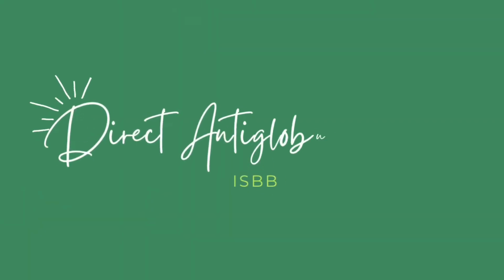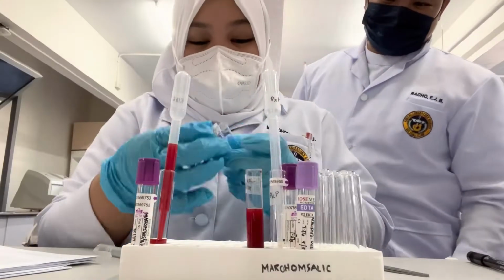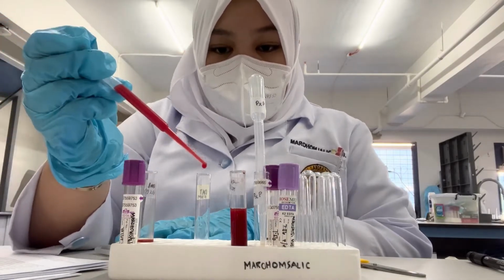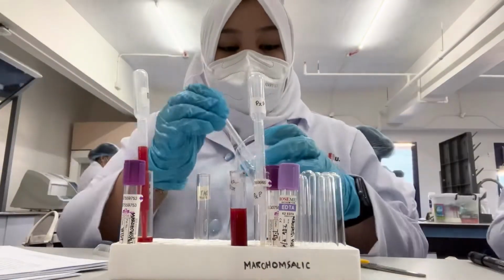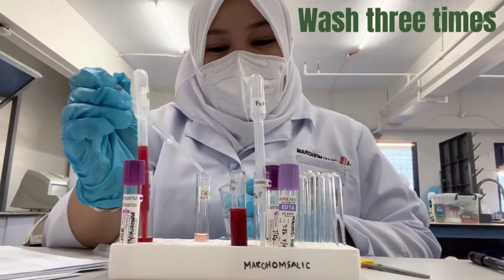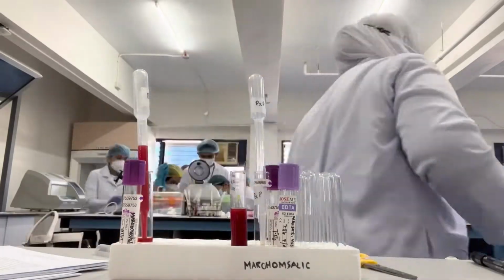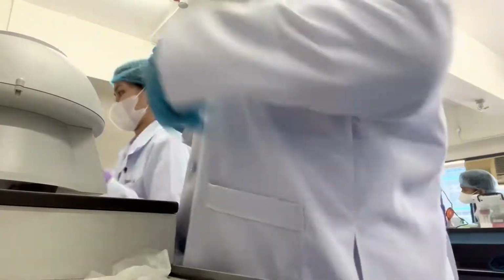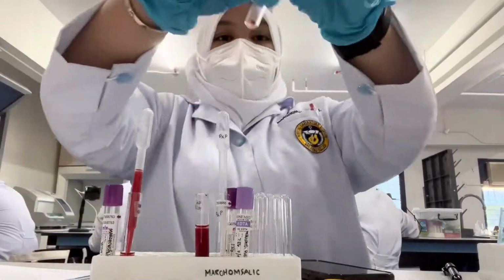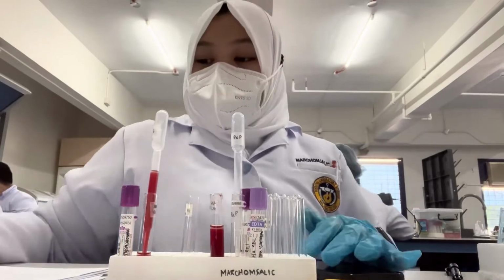Seventh procedure is antiglobulin test procedure. First is to label the tube. Second, add 1 drop of red cell suspension into a labeled tube. Third, wash the tube 3 times with normal saline solution. In this step, follow the procedures presented in washing the RBC. Fourth, completely decant the final wash and blot dry using a gauze or paper towel to remove residual saline.